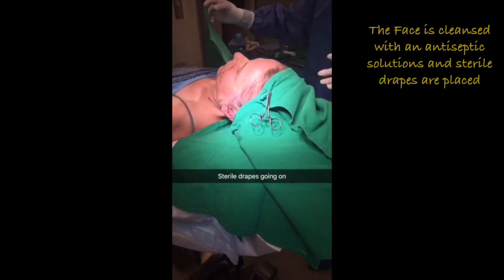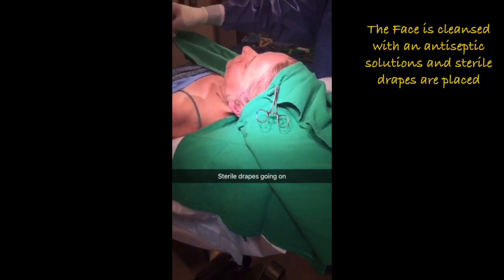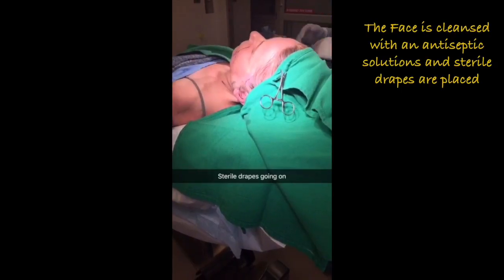I'm just putting some green sterile towels and wrap her up. I washed her with chlorhexidine, the antiseptic solution.